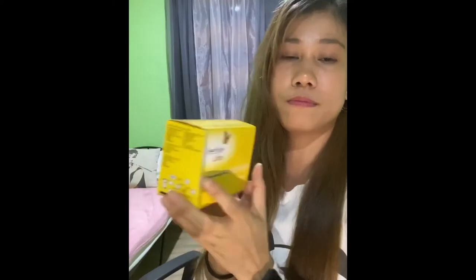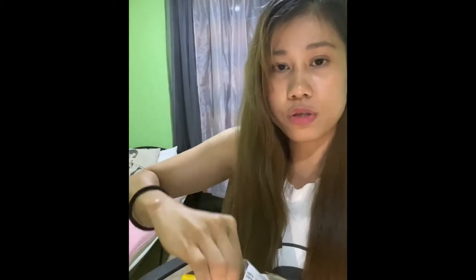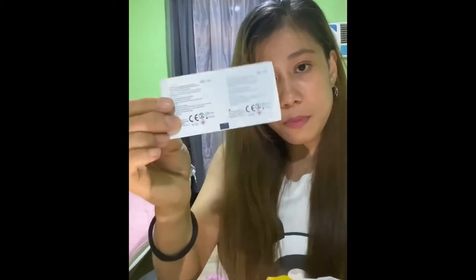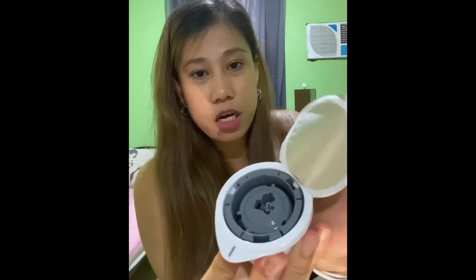So I'm getting ready to put my second sensor. This is the sensor, this is the applicator, and it also comes with two alcohol pads.